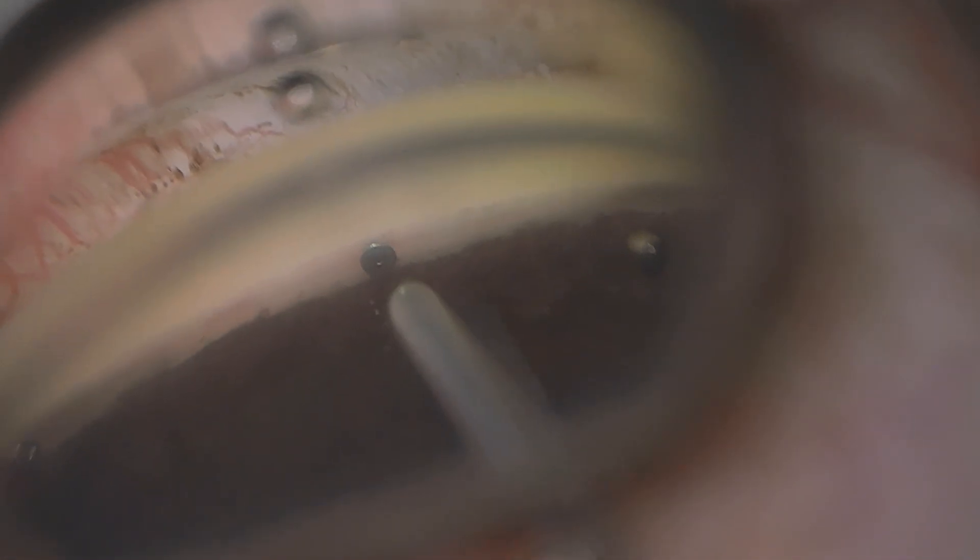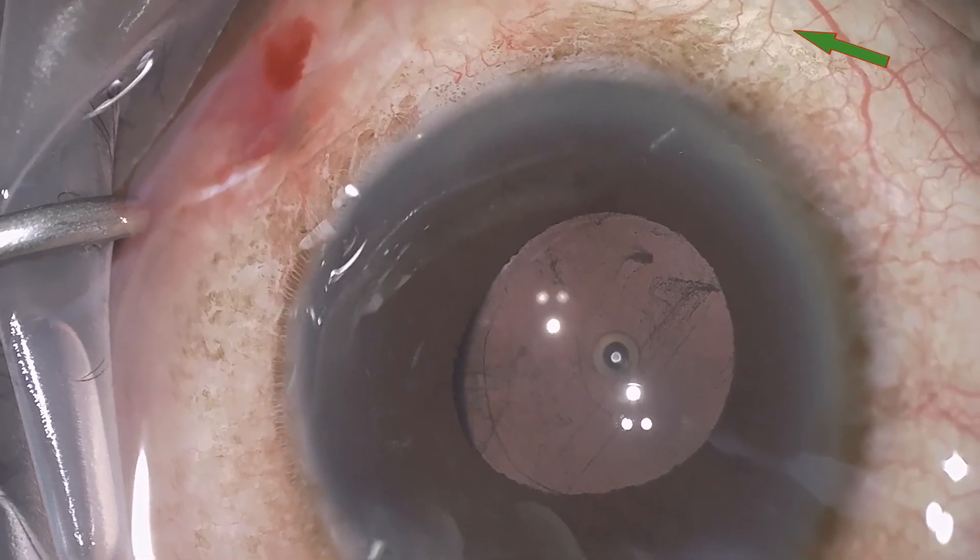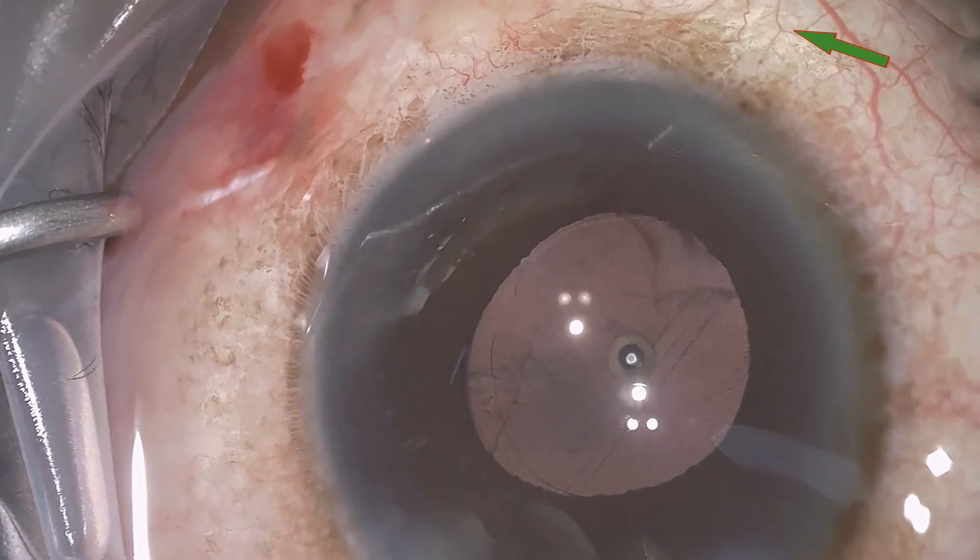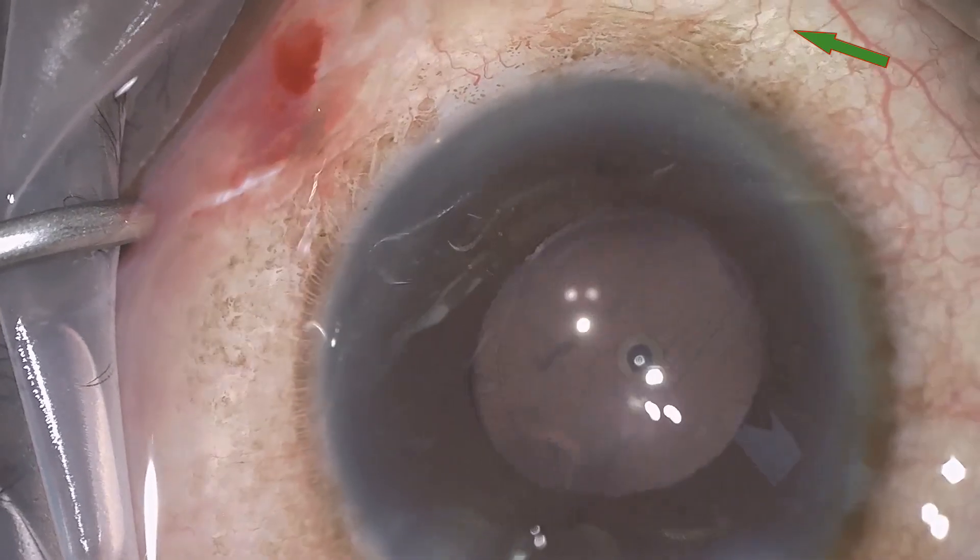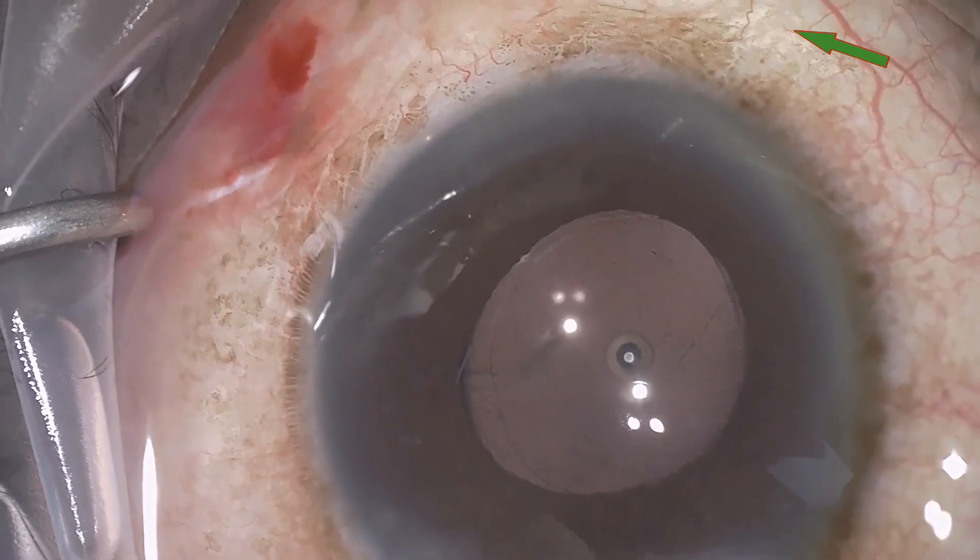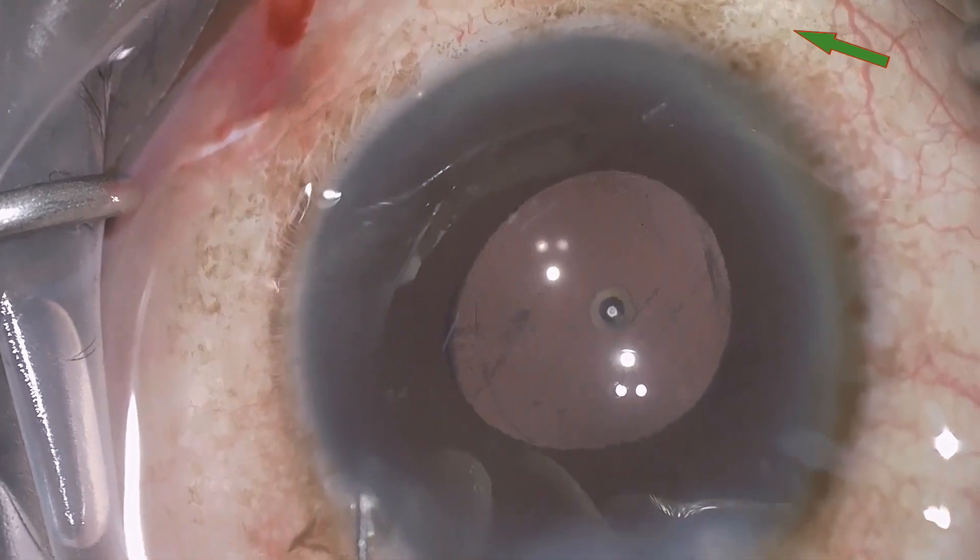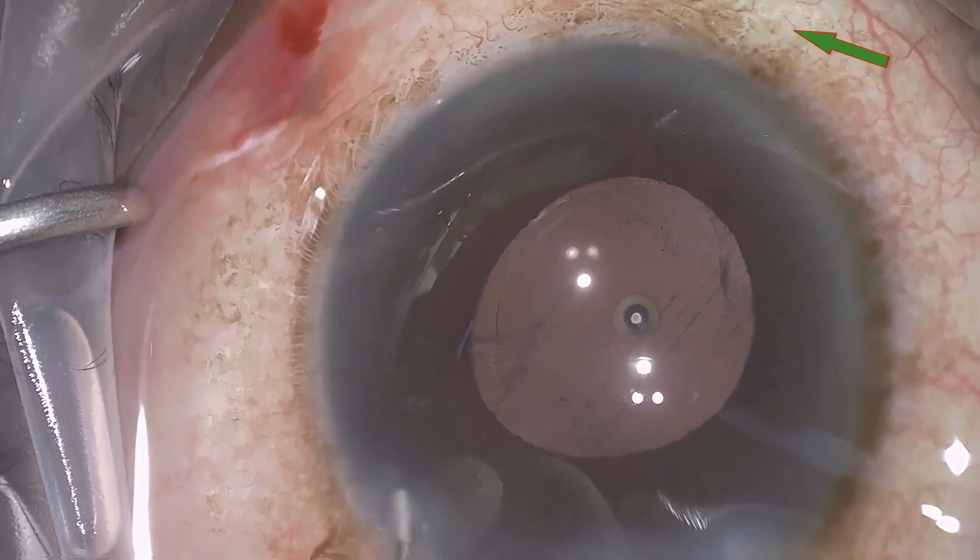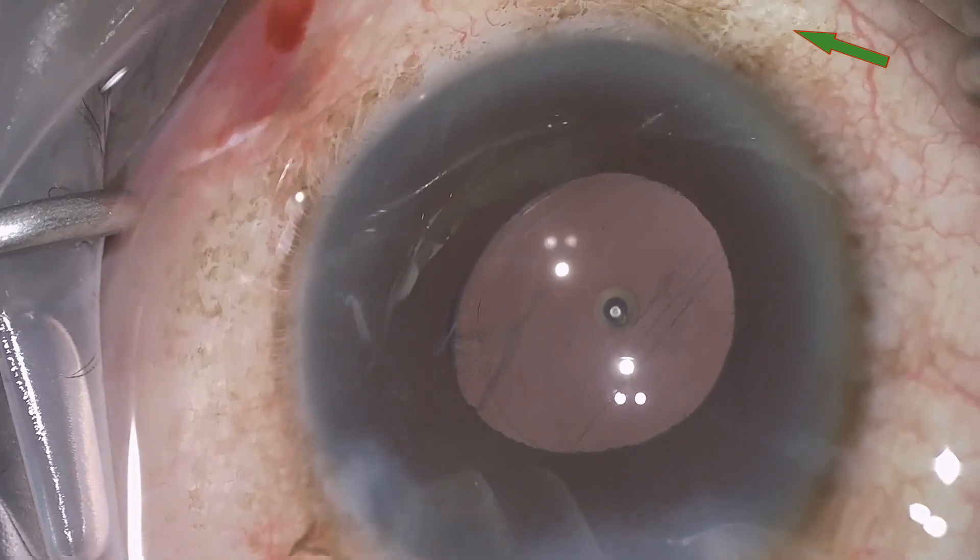And I'm fairly happy there that we've implanted the stent well. And I think it's useful to just tap the stent like that to gain a good view of the body of the stent. Once again, my favorite sign is really to look at this outflow. You can see there the distal outflow again has blanched with the injection of BSS.